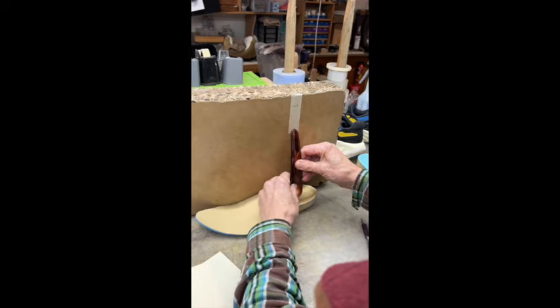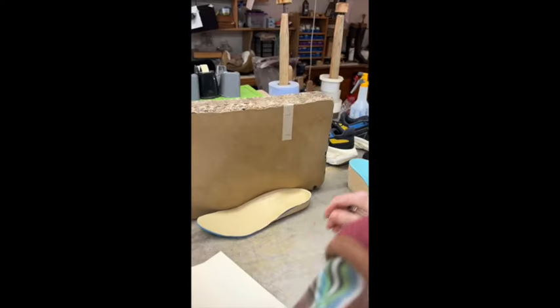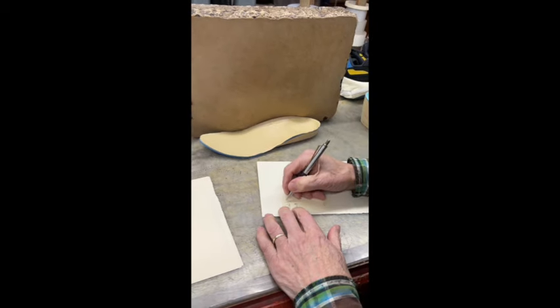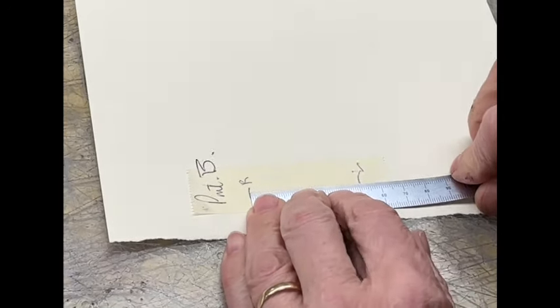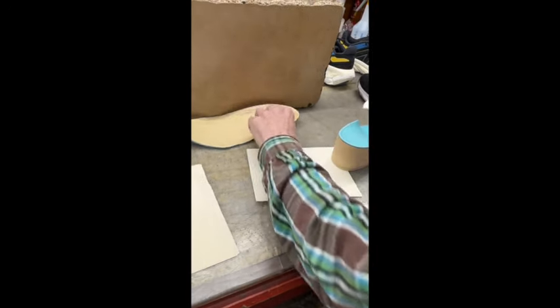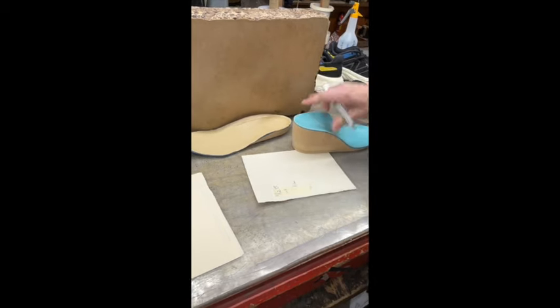Right in the middle under where the leg will be — just pushing it down a bit. Put it on the client's information sheet — this is Patient B. This orthotic is 51 millimeters higher than that. This is way better than going through the sides or adding up, because the actual leg length — the bottom of the tibia — is about there.